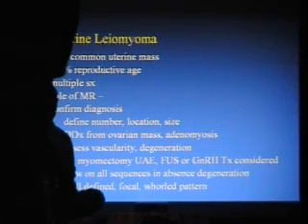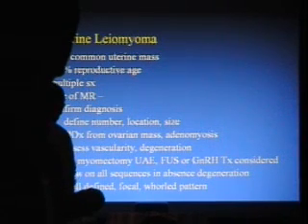A little bit about the role of imaging in MR and CT and fibroids is really not to make the diagnosis. The diagnosis is made clinically on physical examination and very frequently on ultrasound. The role of MR in particular is to confirm that diagnosis. Because adenomyosis, as you know, is frequently confused with leiomyomas, the same presentations, a little bit older, of course, is the patient. And of course, in physical examination, both the adenomyotic uterus and the leiomyomas will feel the same.